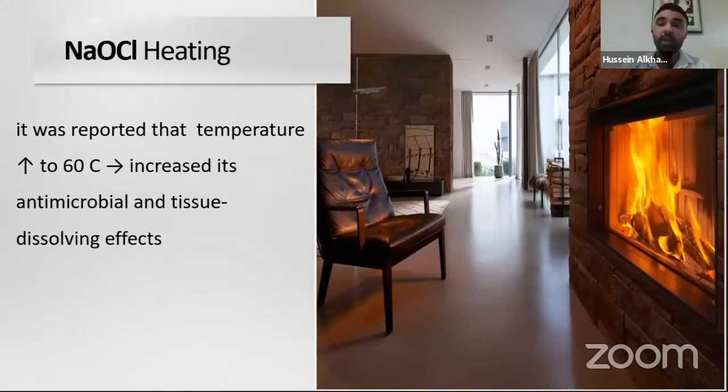Further studies show that when preheated irrigation solution touches the canal wall, its temperature will fall down rapidly and equal body temperature. So instead of preheating, we can use intracanal heating by using activation methods such as sonic, ultrasonic activation, lasers, and so on.